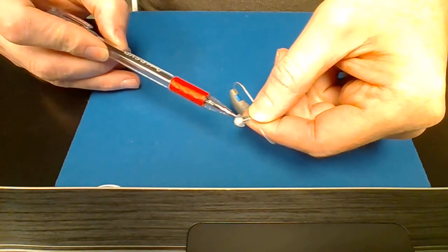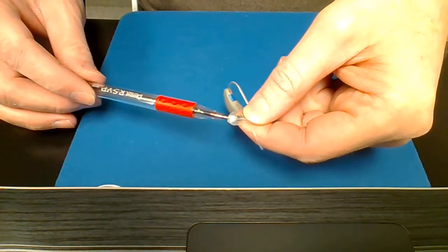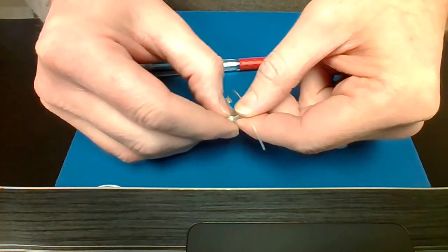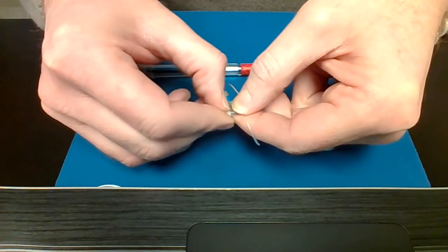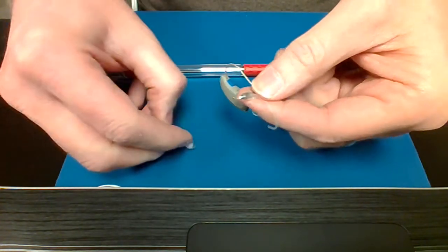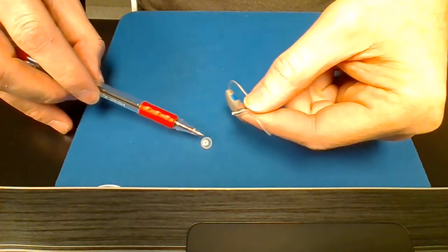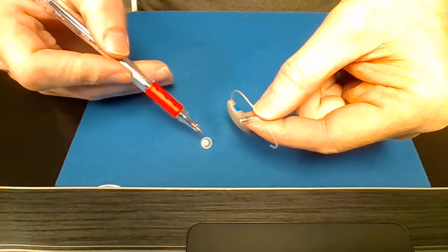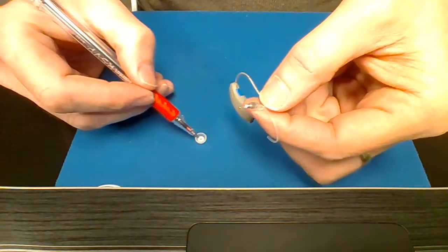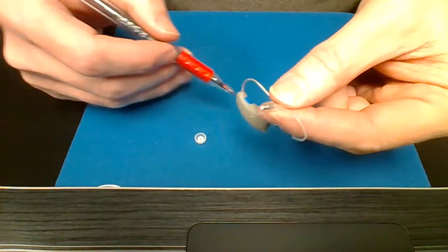That is a white collar. It's hard plastic, and then there is a rubber dome over the top of it. You want to take that and just get behind that hard plastic piece and give it a kind of a twist, and it pops off. Okay? Then once you pop that off, you want to make sure that the whole thing comes off with the soft flexible part as well as the hard white collar. If that hard white collar doesn't come off, the new dome won't go on.